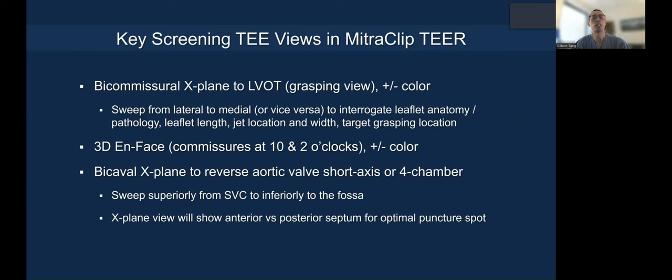The next view is the 3D en-face, where you need to position the commissures at 10 and 2 o'clock, with or without color, to evaluate the pathology and for clip orientation during the procedure.